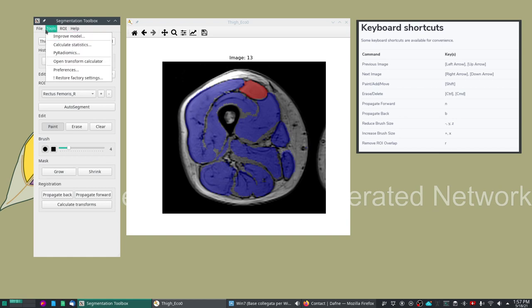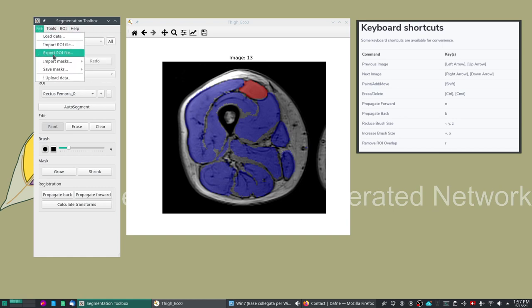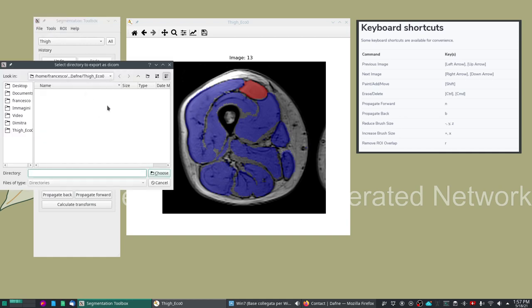Or if you don't want to do these intermediately you can export the mask, you can save the masks. If you've loaded them as DICOM you can save them as DICOM which is what I suggest. You will have the mask exported as DICOM files with the same headers as the original images.